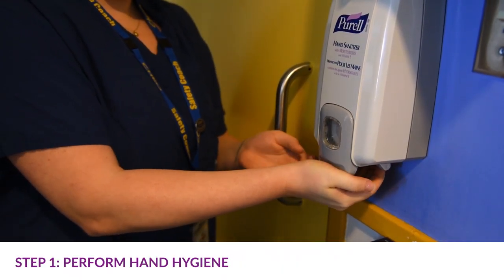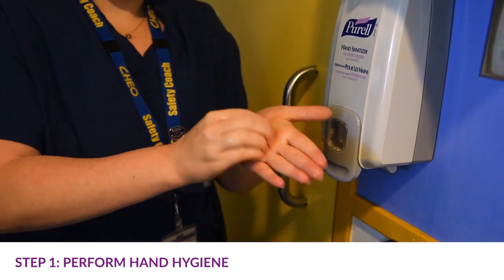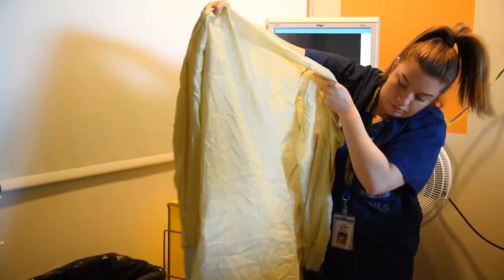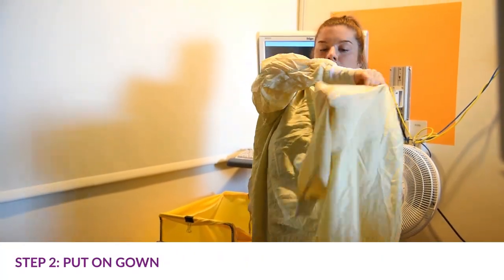Using an alcohol-based hand rub is the preferred way to perform hand hygiene. If your hands look or feel dirty, soap and water must be used to perform hand hygiene.